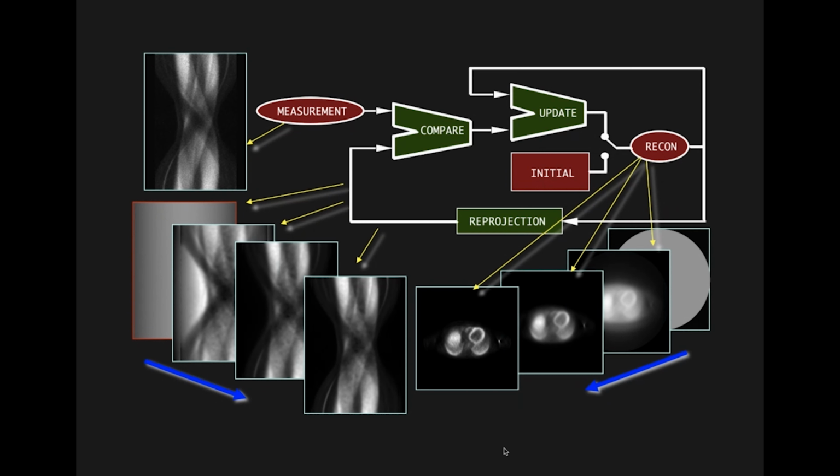In principle, you could even subtract them and find a way to put it, or use a back projection, for example, in order to estimate it. There are different ways to do that, and that's also why you have very different algorithms. We're not going to go into detail on exactly what these are; at this moment, it's not that relevant. The most important is that you have to know that you compare each time the virtual projections with the real measurement. That's the most important.